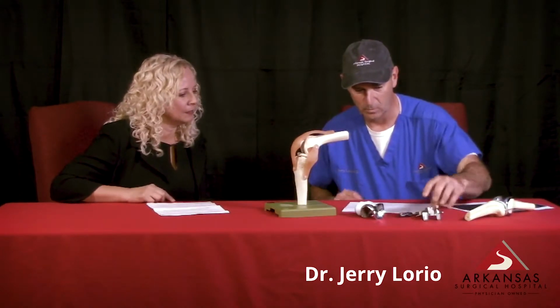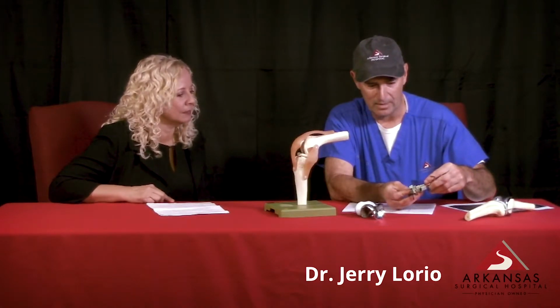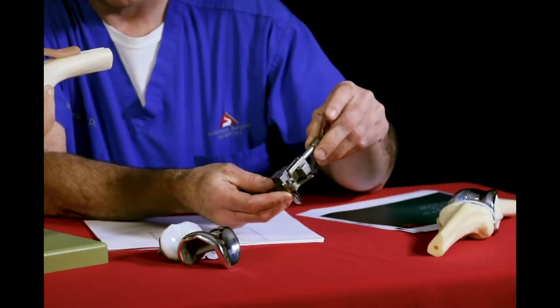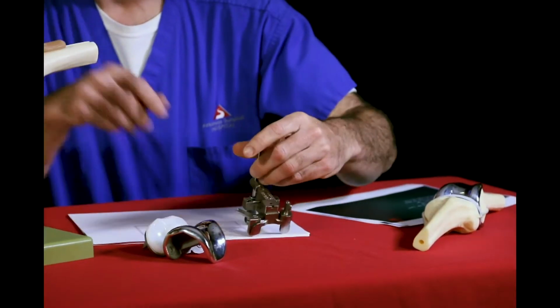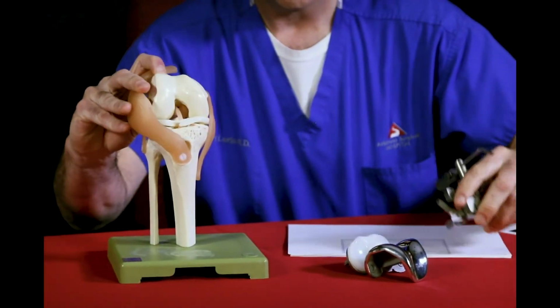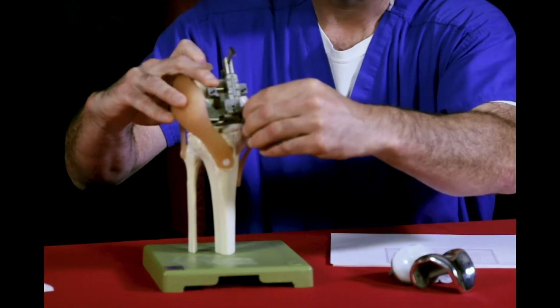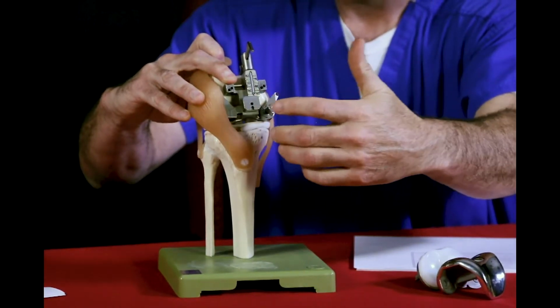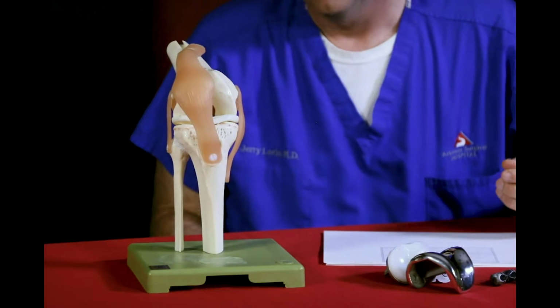But I think as a surgeon, you got to go through and make the decisions and do the work. So I use something different. This is one of the instruments called the Spider that I collaborated with Biomed and we designed. And it is a sizer, but it determines the rotation of the main cut and the flexion contracture. That little component spins. And when I put it in the knee after the first distal cut, I can dial in exactly where this knee wants to be. I tension the gap to get that number. Traditionally, it's 3 degrees.